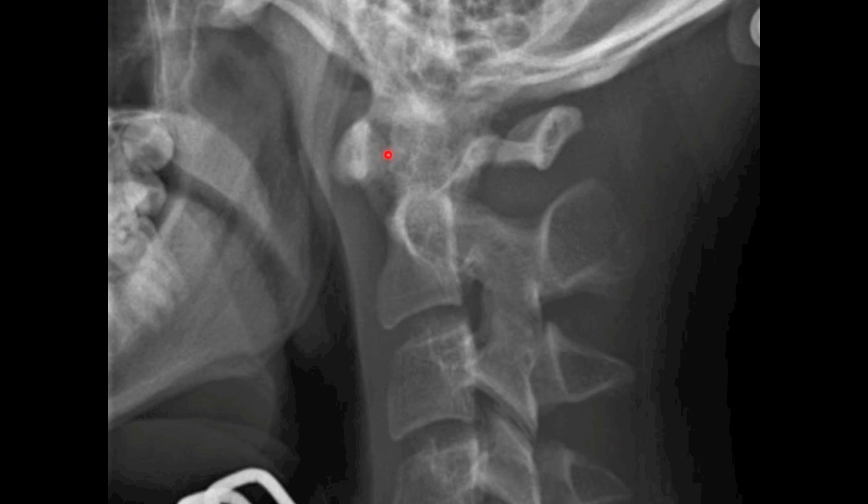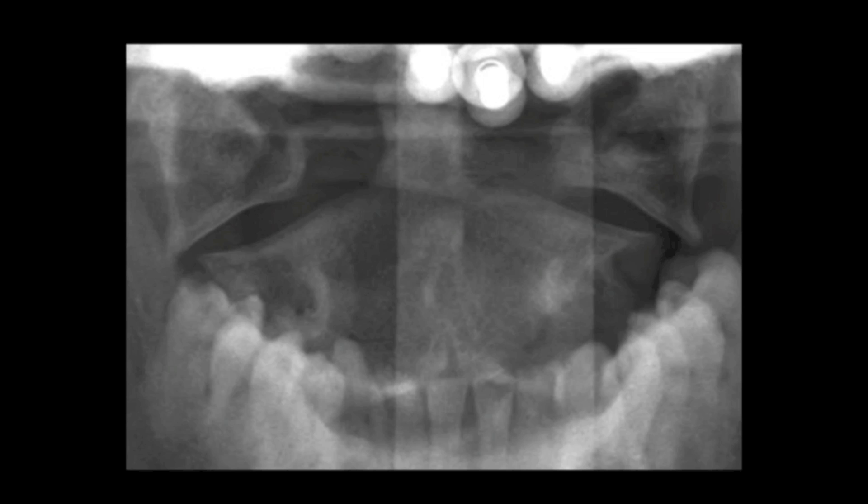You can see here that the atlantodens interval is significantly widened. This should normally be less than 3mm, and you can see out the back there's a lucent line through the posterior arch representing a fracture.